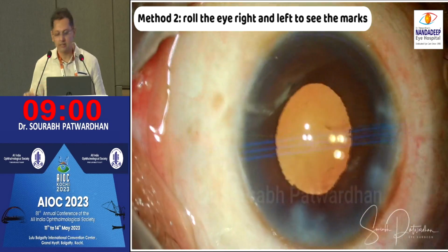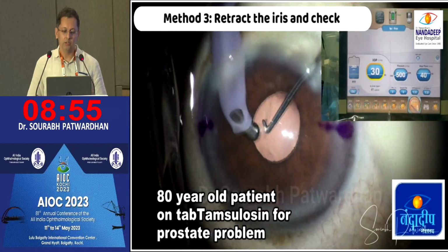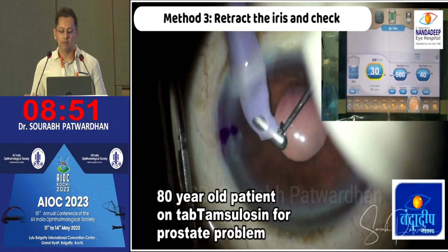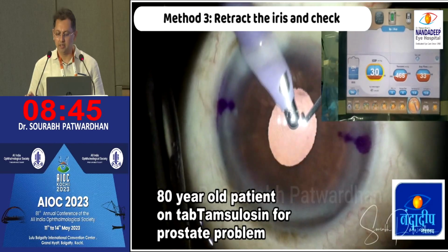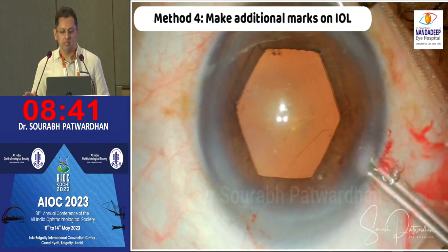Here, in most of the cases I am using a markerless system, but it's the same when you are marked. Now this was an old case where the pupil became too small at the end after putting the IOL, and despite the adrenaline, it's not dilating. So in such a case, it becomes really difficult. I tried all the tricks, but finally I was still not sure.